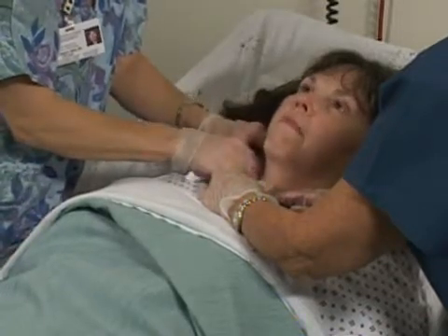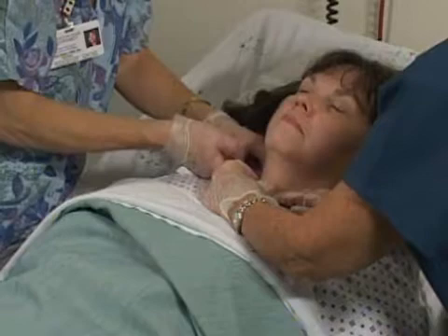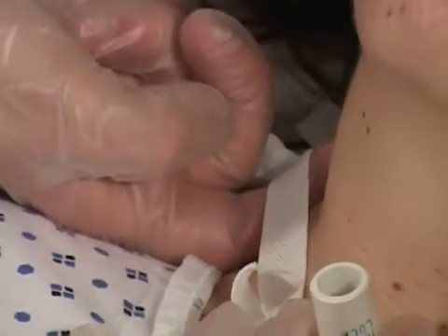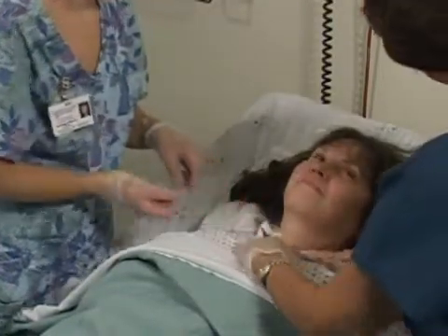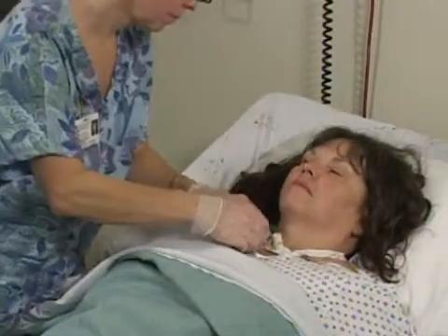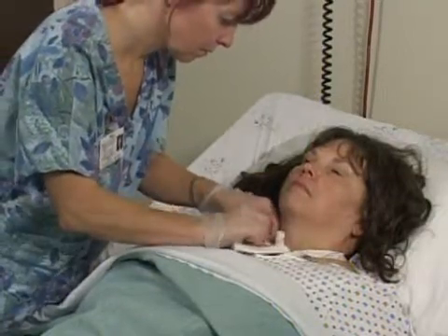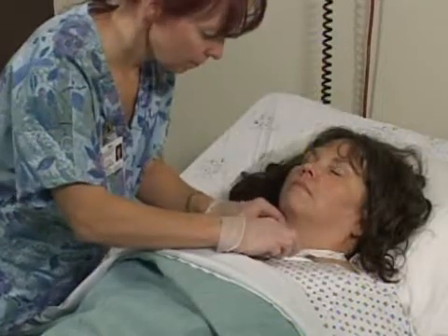Then tie the tracheostomy tapes with a double knot at the side of the neck to avoid any pressure source at the back of the neck. These tapes need to be snug enough to hold the tracheostomy tube in place while allowing one finger beneath the tape for neck movement. The second person can leave now and wash hands. There is a split gauze in the cleaning kit that will slide under the neck plate of the tube to provide a cushion for the skin and absorb secretions. Discard all used materials and wash your hands. Document the client's response to the treatment and that the treatment was completed. This procedure becomes more comfortable for the client the longer the tracheostomy tube is in place. As long as the client is made to feel secure and secretions are frequently removed, the tracheostomy cleaning procedure should feel safe for the client.